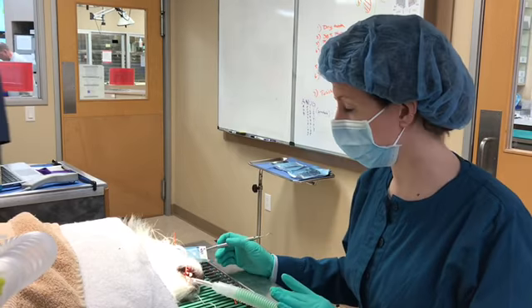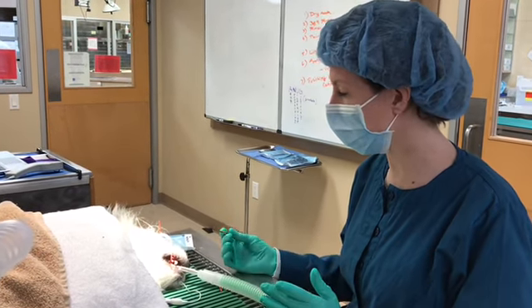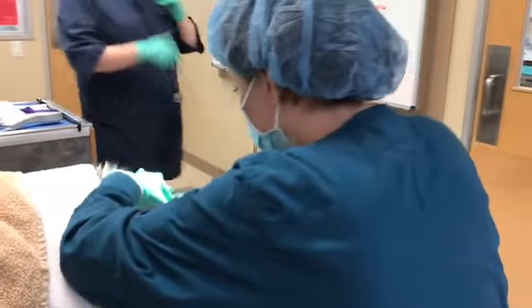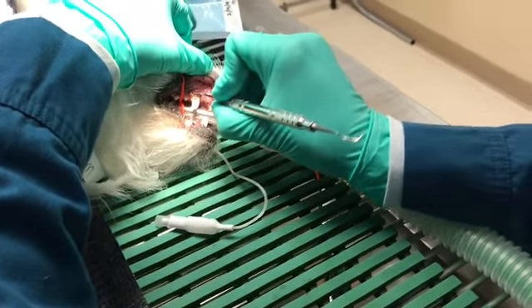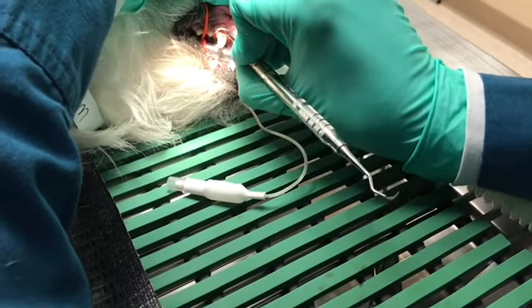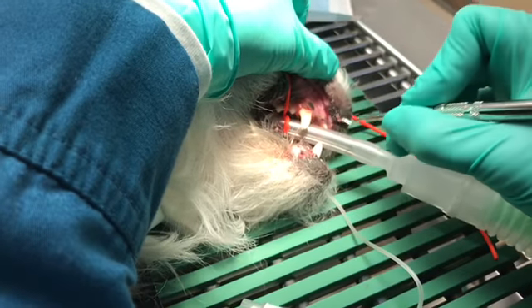For this video I'm going to demonstrate hand scaling. I've got my curette here, and I'm going to start up at the top of the tooth and pull down to try to get some of this plaque.